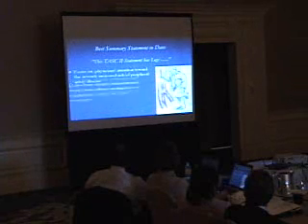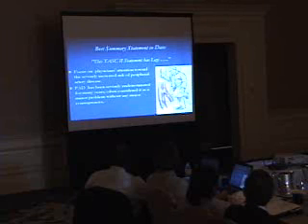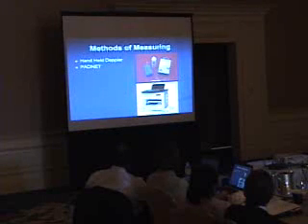Best summary statement to date would be focused on physicians' attention towards the severity of increased risk of peripheral arterial disease. And PAD has severely been underestimated for many years, often considered as a minor problem without any major consequences. Methods of measuring can be a handheld Doppler, or one of the systems that's out there is a PADNet system currently.